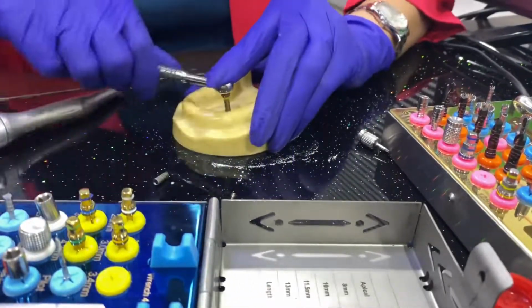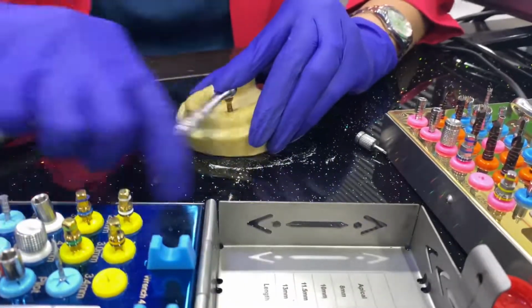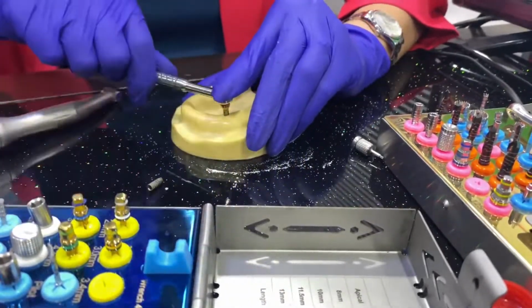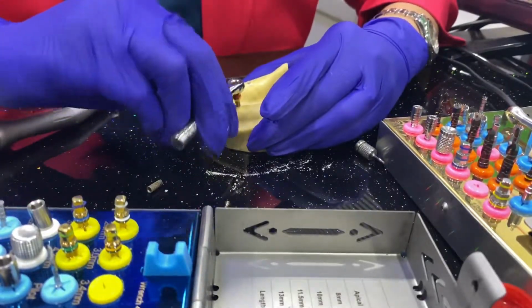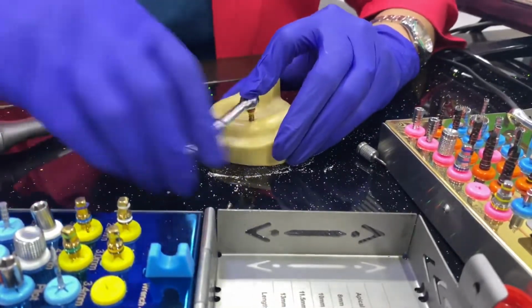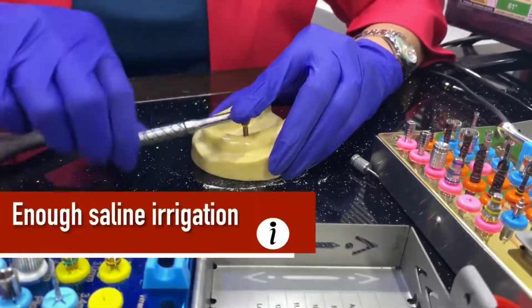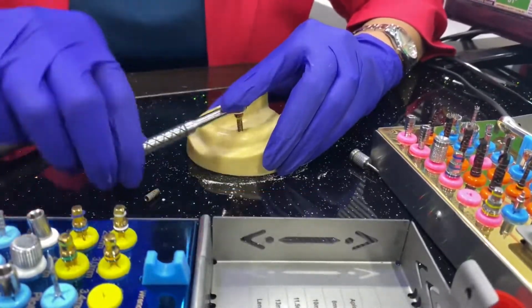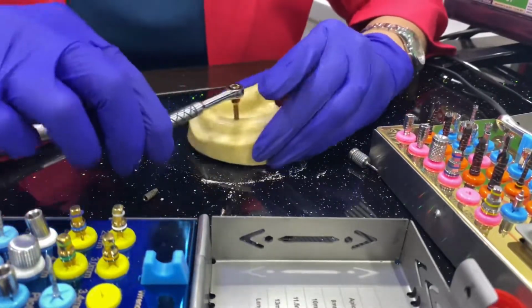So as you can see, I haven't drilled. Only one drill was used and everything else I have used the expanders. And now I am again reverse torquing this out. And again, let me remind you, in between use saline irrigation between each expanders. I am not using it here because this is a dummy mandible, but you have to use it in patient's bone.